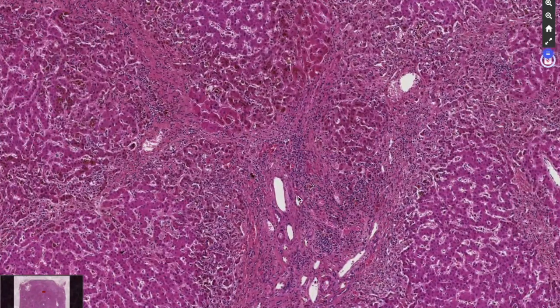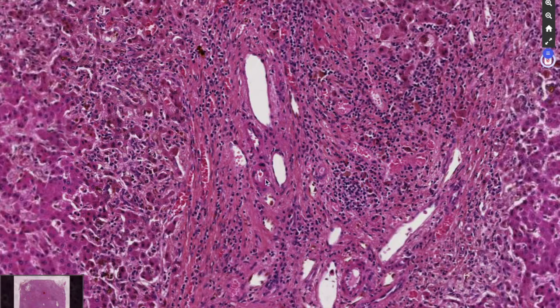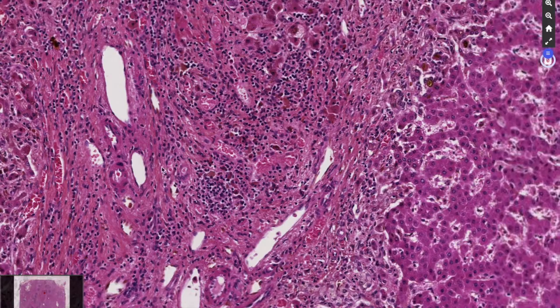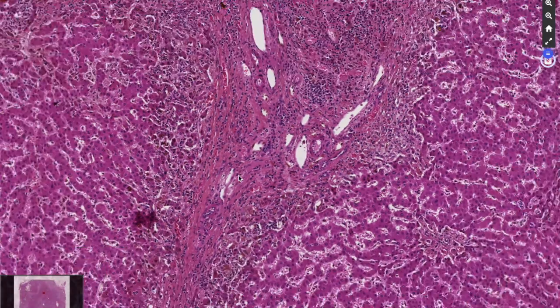and the fibrotic bands. So you have here some structure, an artery, vein, you have some inflammatory infiltrate, mainly lymphocytes, maybe some polynuclears, also macrophages, and also some plasmocytes. Again, one artery.